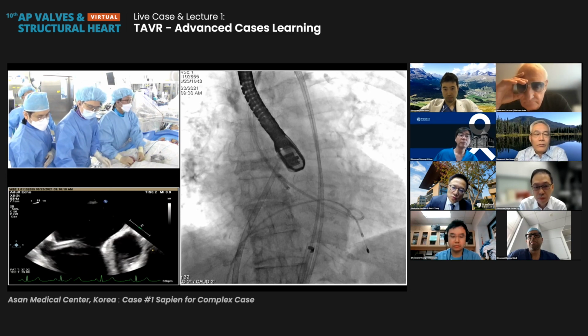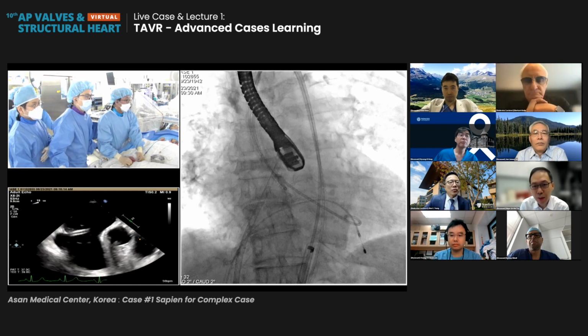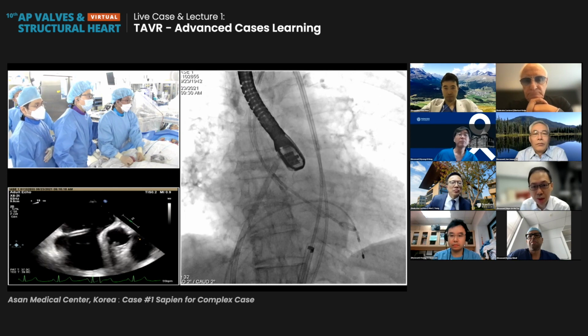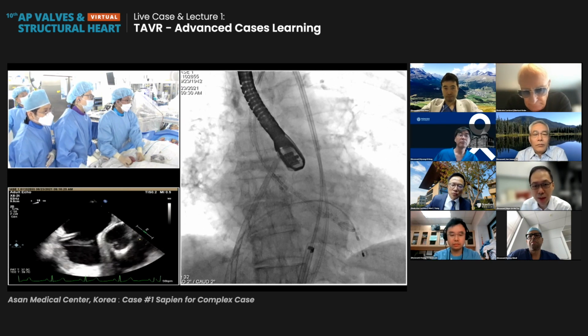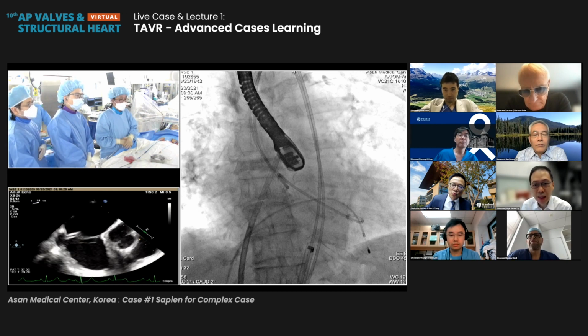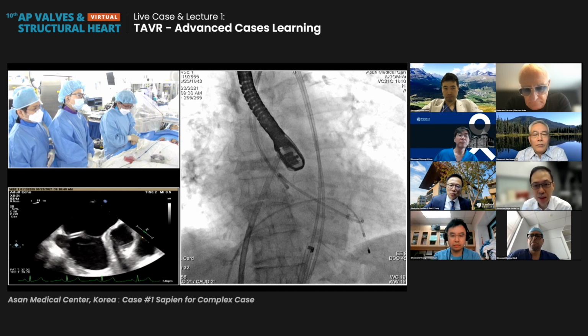Can I just make a short comment? I think I agree with Yohei's comment that some of us would separate the closure from the TAVR procedure. One of the main reasons is that in patients with severe AS, the left atrial pressure is typically elevated. If you close the ASD, some patients may feel this increase in left atrial pressure the minute the procedure is done, and sometimes they feel a little bit short of breath.